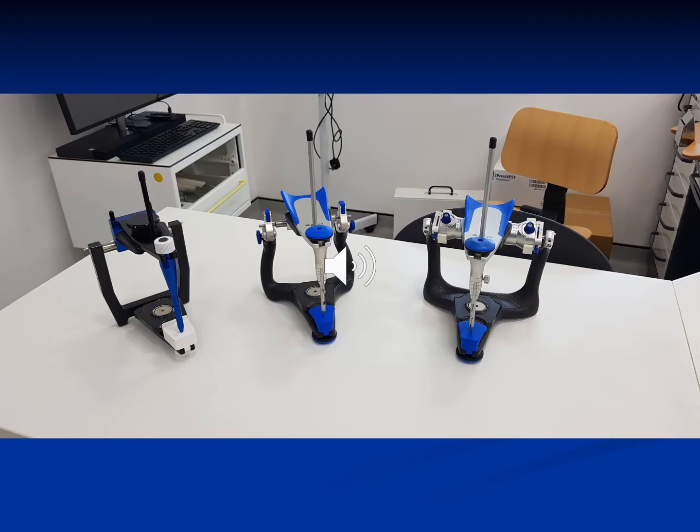Here we have a different view of the articulators just seen in the previous slide. Now we can say that the most left articulator is the class 2 average value articulator. Average value articulators follow the Bonwell theory. Bonwell theory was based on measurements of mandibles of cadavers.